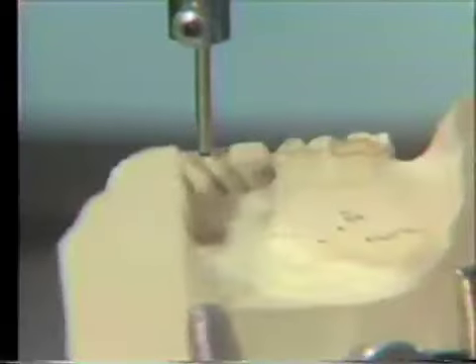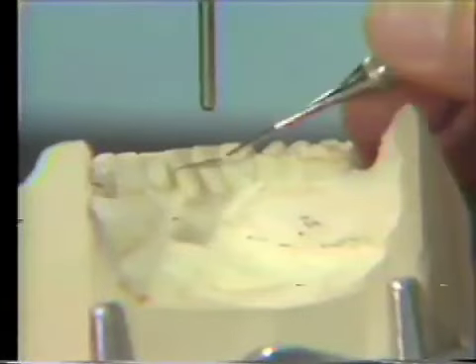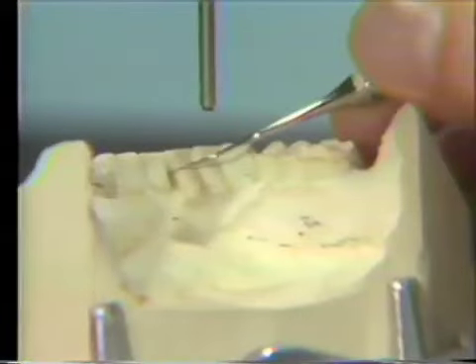So let's go a little bit higher, and I'll attempt to go to this junction where these teeth come in contact interproximally with each other. That would be a reproducible position, and try to keep that in the same plane with maybe several others. Okay, I'll go from there and search for another position.